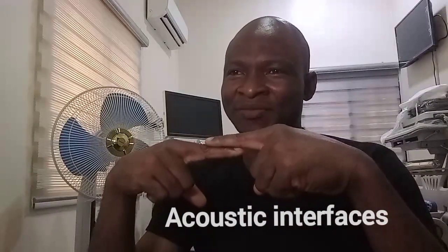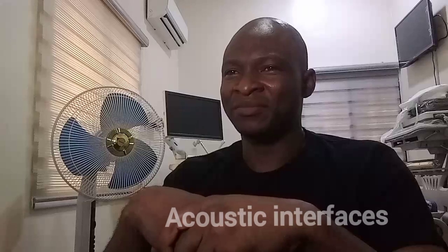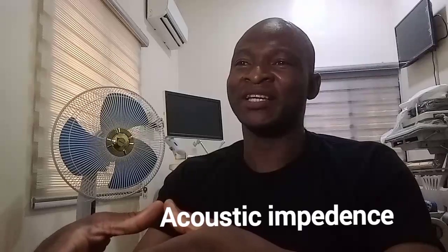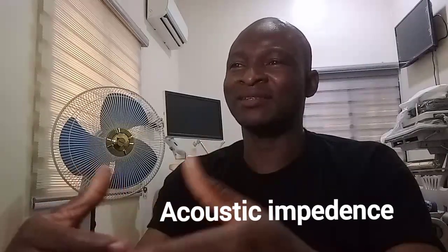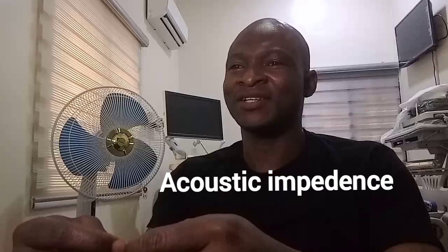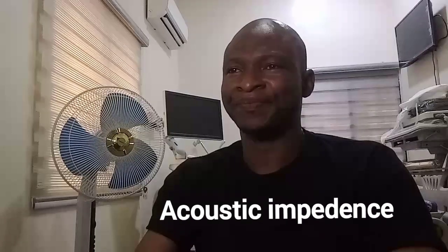Let's look at acoustic interfaces. Acoustic interfaces are media boundaries which reflect part of the sound energy in incident ultrasound beam. For diagnostic ultrasound purposes, interfaces exist where the media boundaries have different acoustic impedance. Acoustic impedance is a value which indicates a material's resistance to the propagation of sound. The acoustic impedance is the ease with which a sound wave can form within the medium.